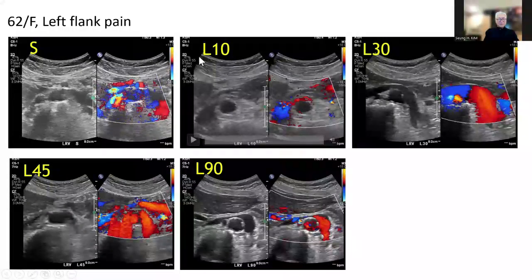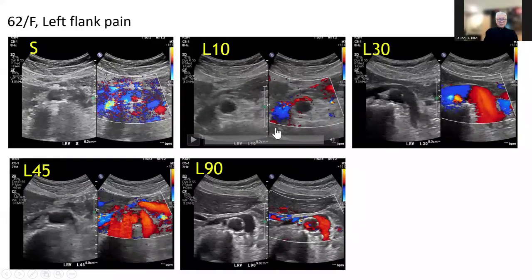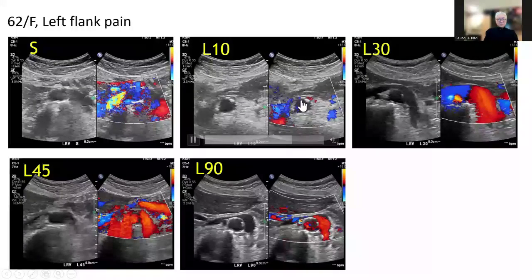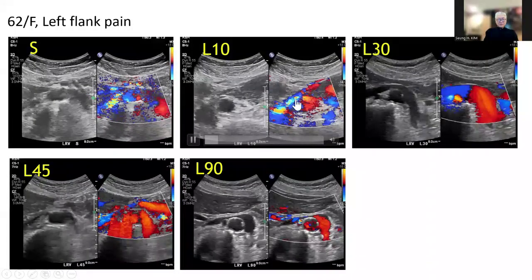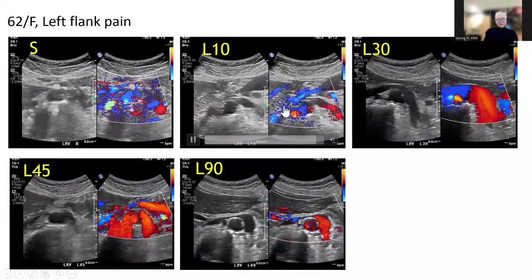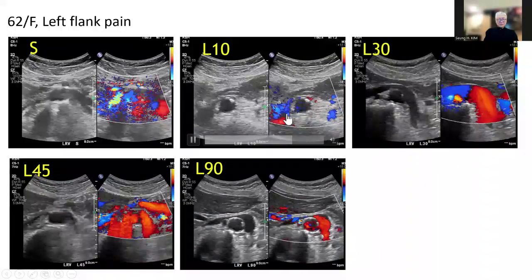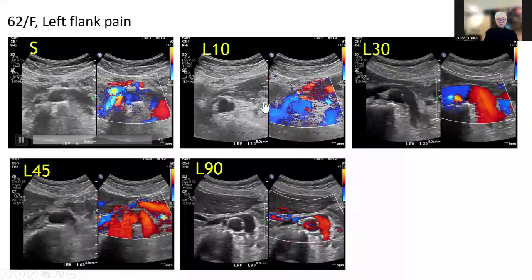lateral vein. If we have the patient rotate a little to the left side, about 10 degrees, a subtle rotation of the body, then it's quite different. Now we see intermittent flow signals here, and also fast flow here. The flow with this subtle rotation is very different from the flow in the flat supine posture.